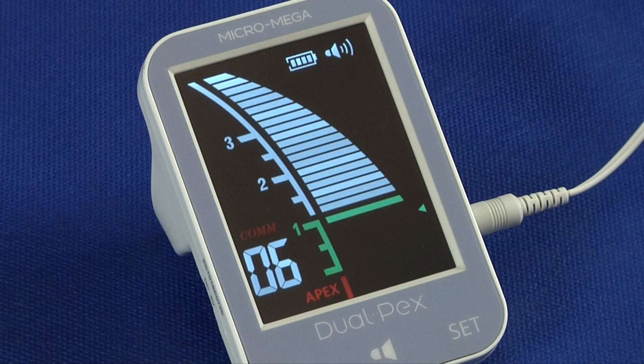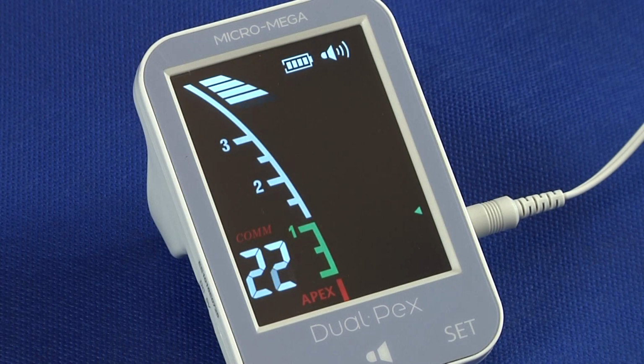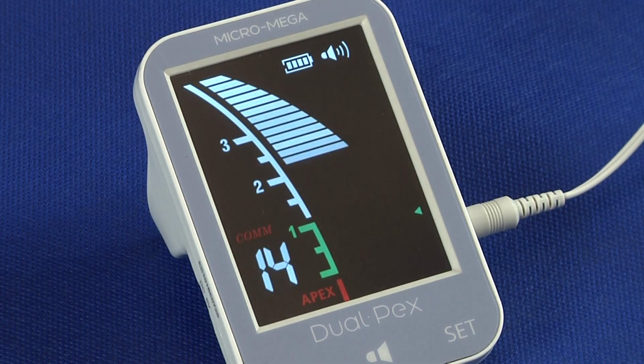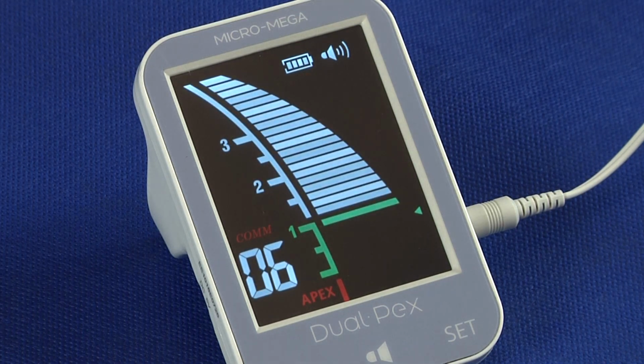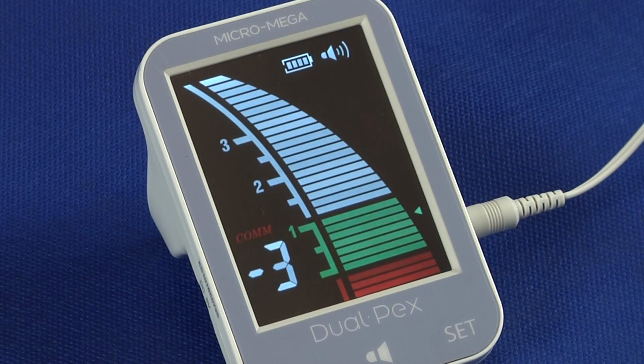The green scale is then divided into 7 different regions or steps, between the apical constriction corresponding to bar number 6 and the apical foramen, bar number 0. An audio feedback is provided in the form of progressive rate beeps. When the apex is reached, the beeps change to a solid tone. If the apex is passed, a warning sound is activated.